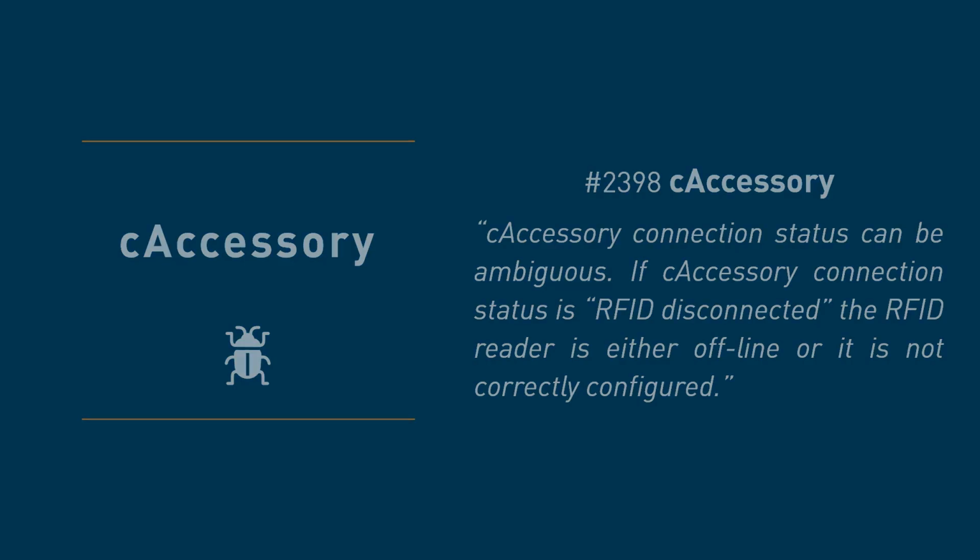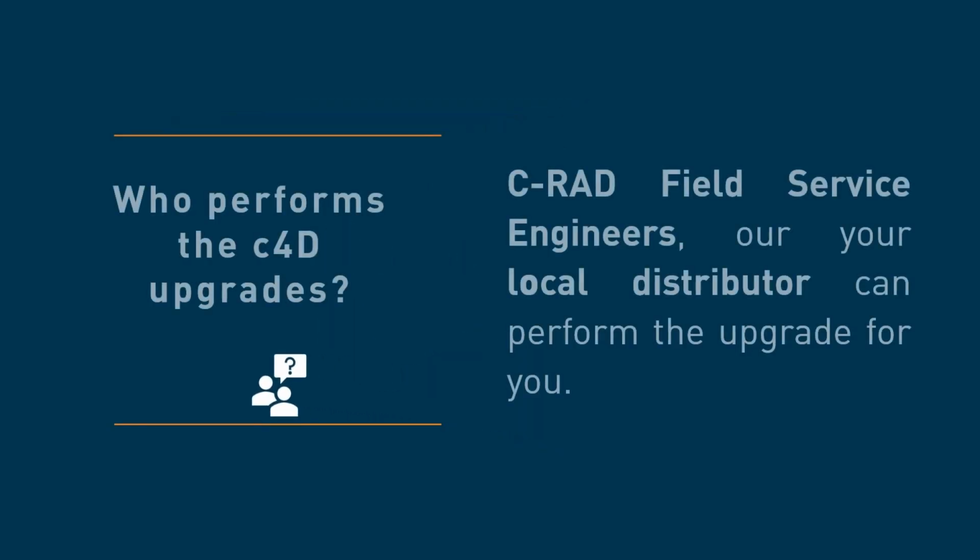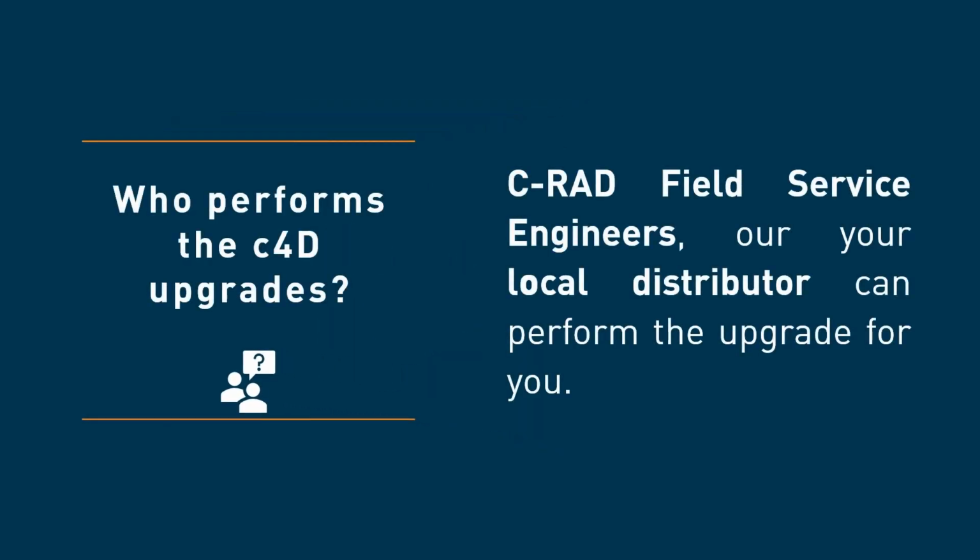And this brings me to the last chapter, which is the frequently asked questions. So one question could be, who performs the c4D upgrades? The c4D software upgrades are performed by the C-RAD field service engineers, of course, or by your local distributor, either during an installation, a preventive maintenance, or a service visit.